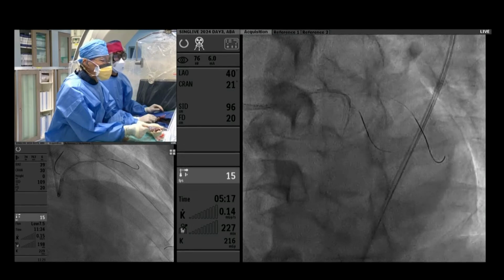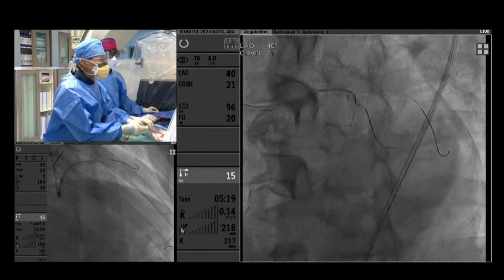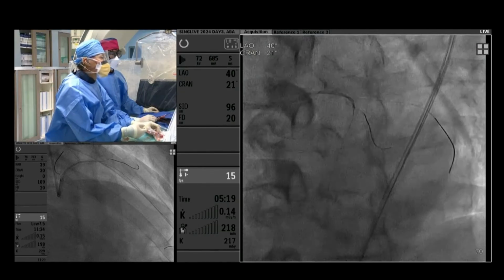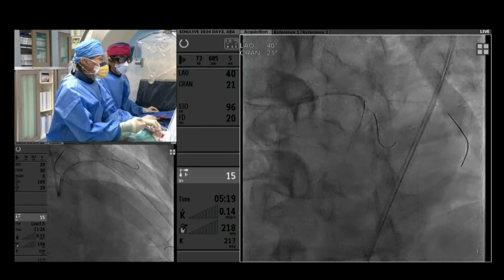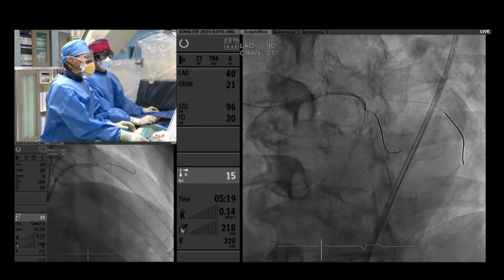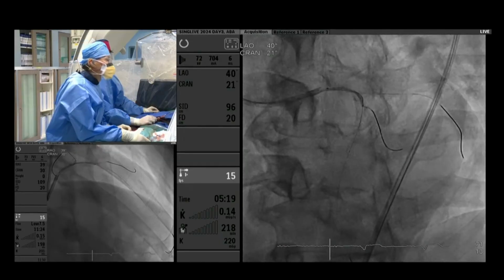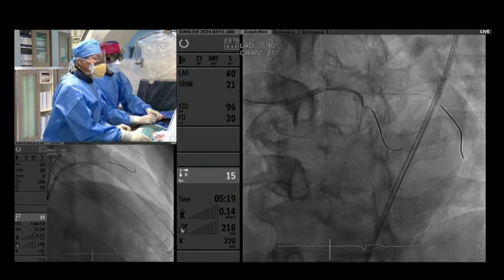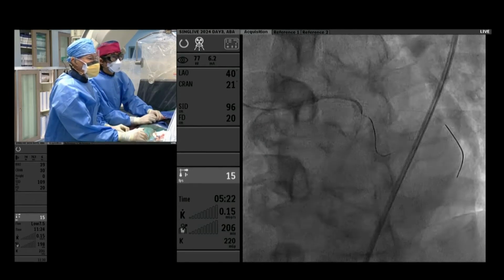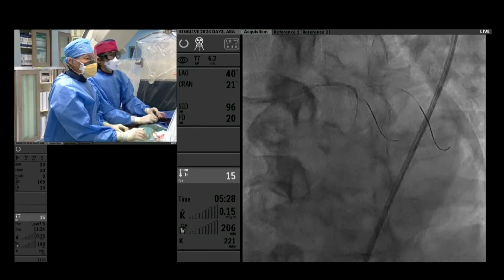Alan, when it comes to ostial left main stenting, would you consider putting an anchor wire to guide what we call a Szabo wire technique? It depends on where you're going to land your proximal stent. If we go to the real ostium, usually I just put a wire in the LCx, first of all to prevent your guiding going in, make your stenting easier, and also delineate your exact position. Of course, nowadays the so-called Szabo technique is a little bit out of favor. We're still doing it a little bit, but not many. Anyway, there are lots of tips and tricks to precisely place the ostial stent. But this one, you're not going to land at the ostium, right? So you need some contrast.